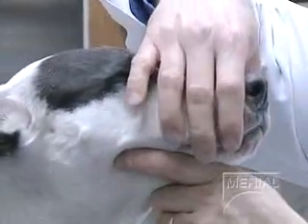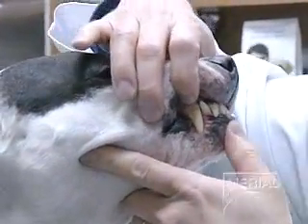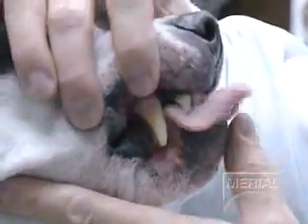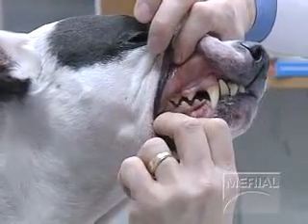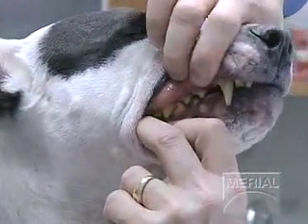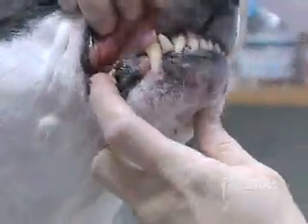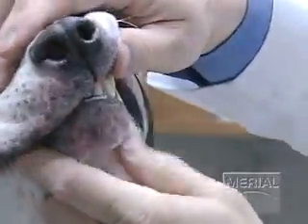And then finally we flip the lip. By flipping the lip — which is what I like most pet owners to do at home — we get the pet used to opening their mouths. This can start when they're a puppy. This should be a reversible stage of periodontal disease. I would put this at stage one periodontal disease, meaning that we do have some inflammation within the gums — what we call gingivitis.